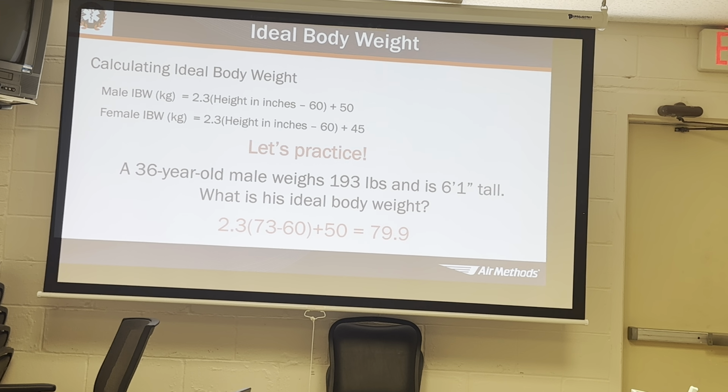Okay, so yeah. Really, this is kind of the bread and butter of respiratory therapy. But if you notice, wow, it seems like she's getting like 500 mLs, and she's like 4 foot nothing, that's way too much. That's where we have the opportunity to say there's something not right here. This seems like an awful lot of volume for such a small person.